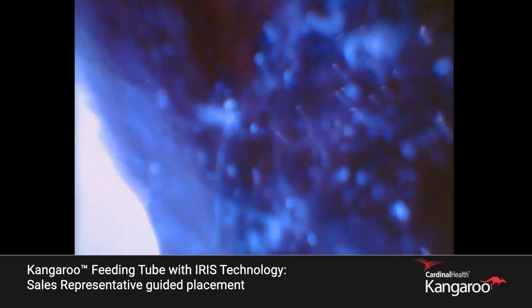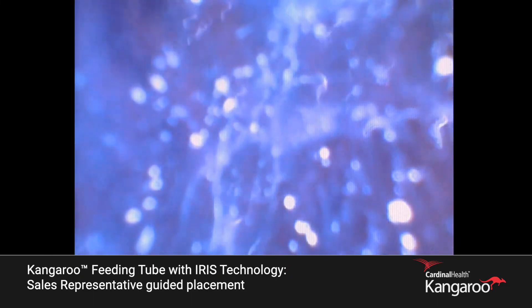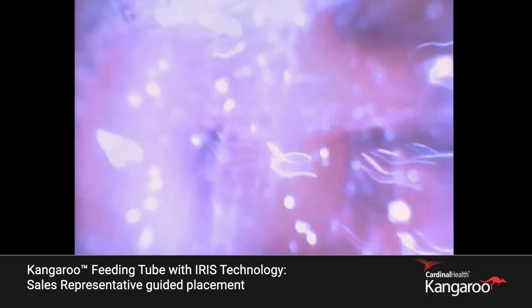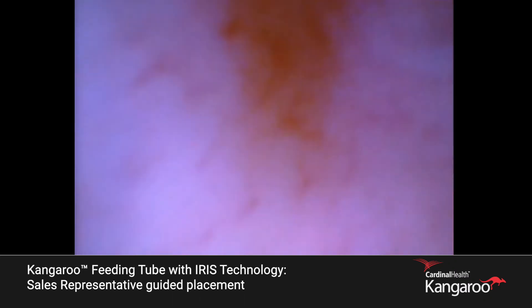Now let's advance toward the 70 centimeter mark. Let's take our time and let the tube ride the wall of the stomach. Slowly advance, centimeter by centimeter. We're looking at the tissue wall of the stomach — you'll see the vascularization and even the freckling of the tissue itself.